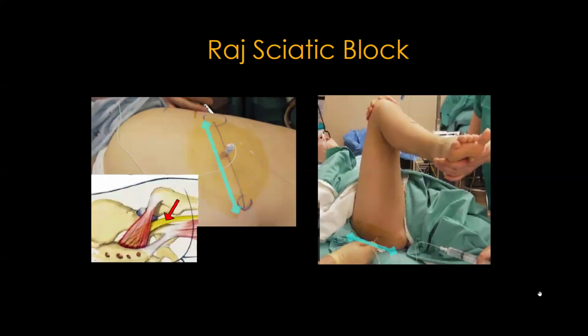So I would just give them 10 milligrams of ketamine, 1 cc of propofol, put them on their side, put on a gown, because you've got to get up in there. And curvilinear probe, push in there, feel the greater trochanter and the ischial tuberosity, look for a big old nerve and whack it. And I'm not too worried about it because, what are you going to get? Foot drop? No, they're doing an AKA. So I can be aggressive here. I need that block to work.